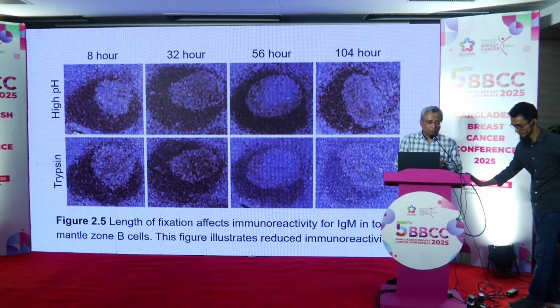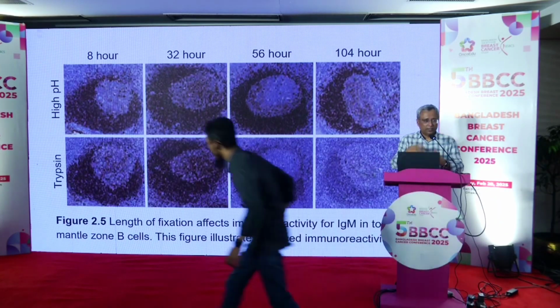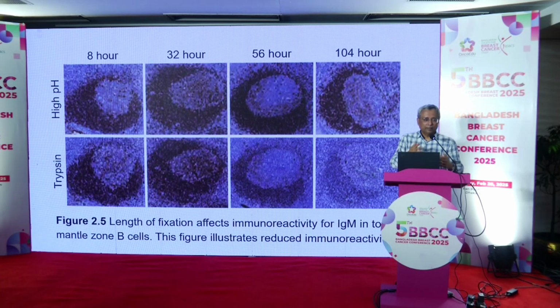Because if you don't know the protocol, and there's some variation, say instead of using a high pH, 1 week they're using low pH, and you are not aware of this transition, you'll be misinterpreting your stain. So even if you are not used to going into the lab, you should be talking to the technician and find out how things are done.